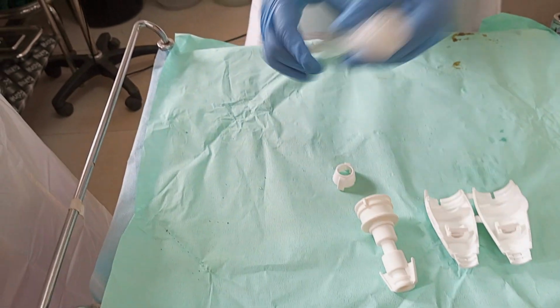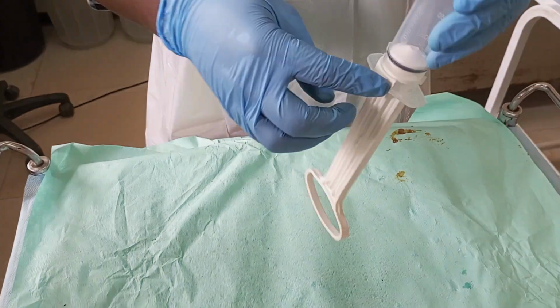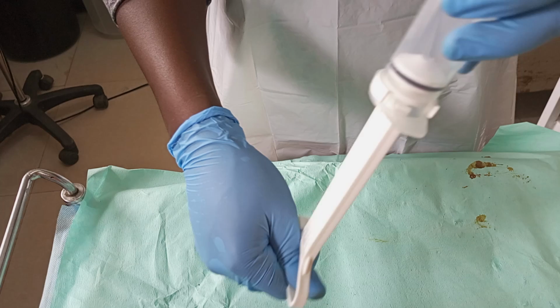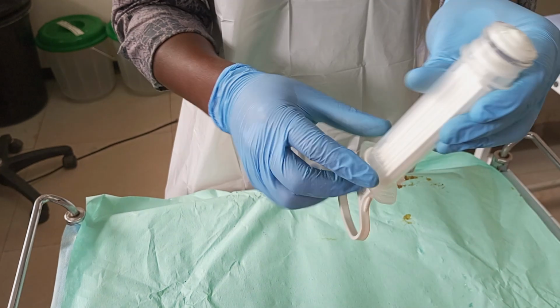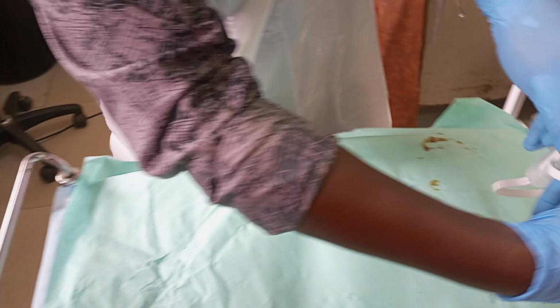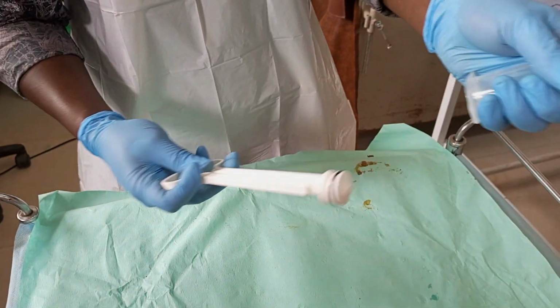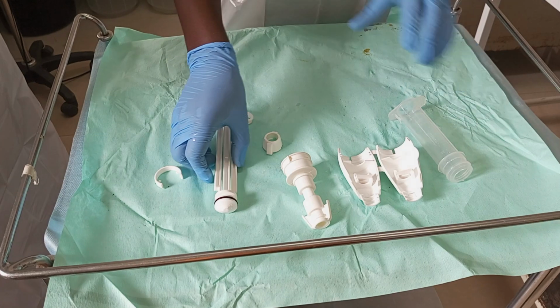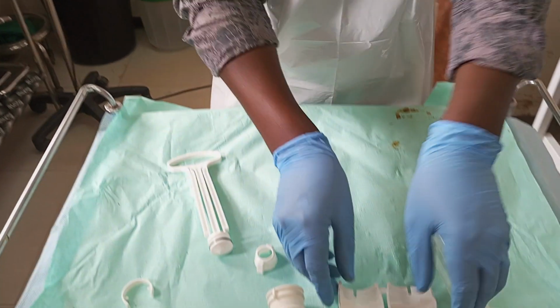We come this side. Remember, you cannot remove the plunger directly from the cylinder because there's a stopper which is preventing this plunger from coming out of the cylinder easily. So the best thing to do at this point in time is first to remove the stopper, this one here. After this, you can easily remove the plunger. We have dismantled everything.